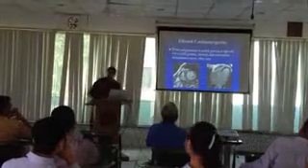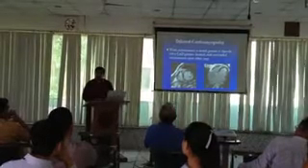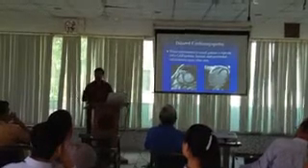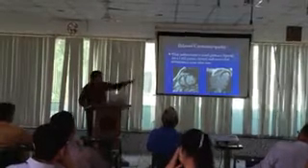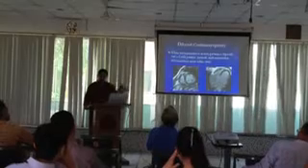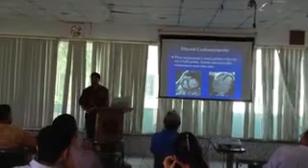40% specificity. What's the 40% you have? Sir, in 60% there would be no enhancement, so it is very clear. In 40%, remaining 28% will have a mid-myocardial stria. So that also is easy to differentiate. So in 12% cases it will be difficult to differentiate from ischemic.